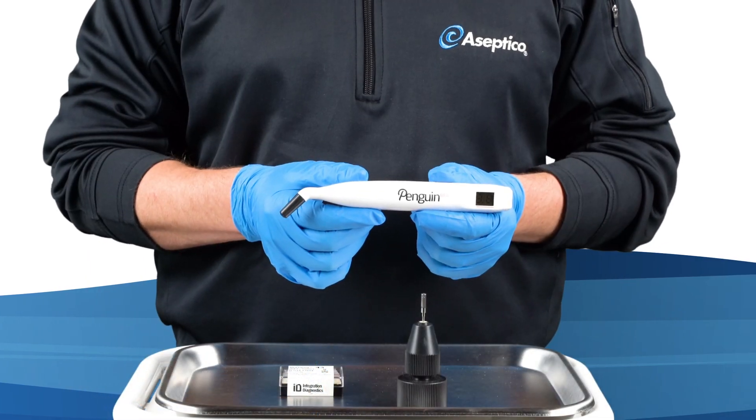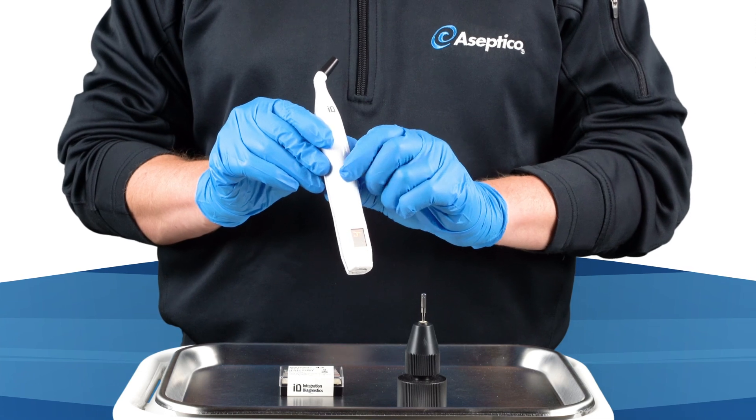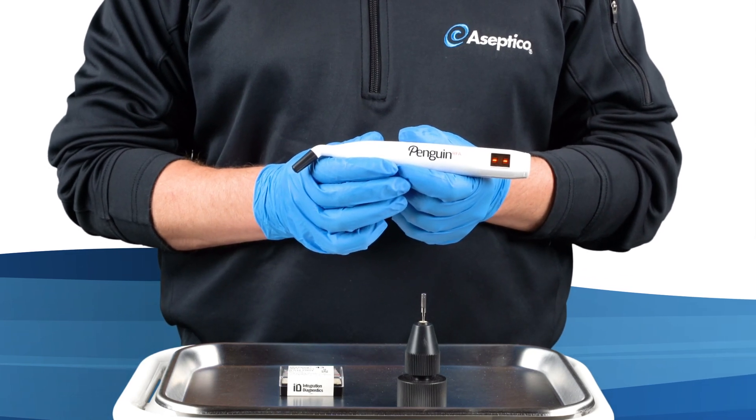Here's how the Penguin works. To activate the device, simply press the black control button. The firmware version will quickly appear on the twin displays, followed by two dashes indicating that the unit is ready to take a measurement.